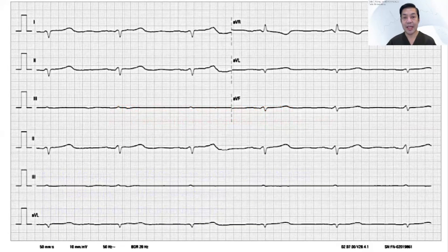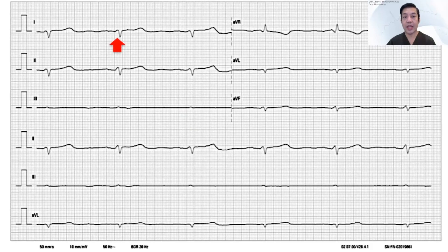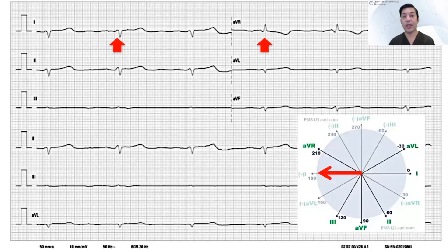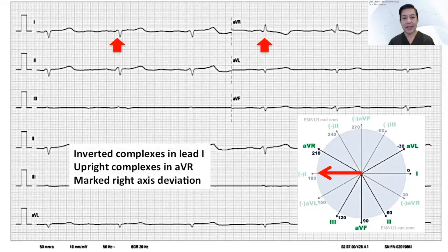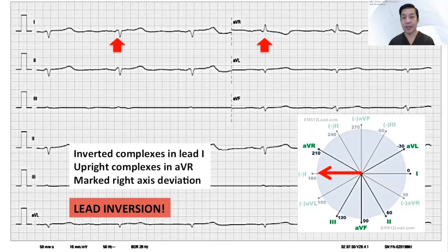Let us re-examine this ECG, specifically the axis. We notice that the complexes in lead 1 are all inverted and in AVR they are all upright, which is quite unusual because lead 1 is usually positive and AVR is usually negative. Secondly, in the hexagonal axis, we measured severe right axis deviation at 180 degrees. In fact, inverted complexes in lead 1, upright complexes in lead AVR, and marked right axis deviation make us suspect the presence of lead inversion — in this case, right and left arm lead inversion, meaning the electrodes on the right arm and left arm were actually interchanged.